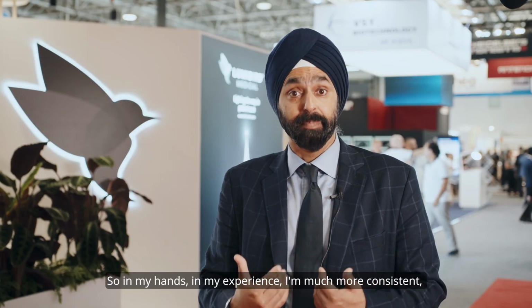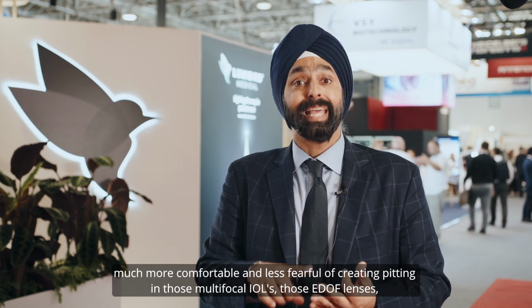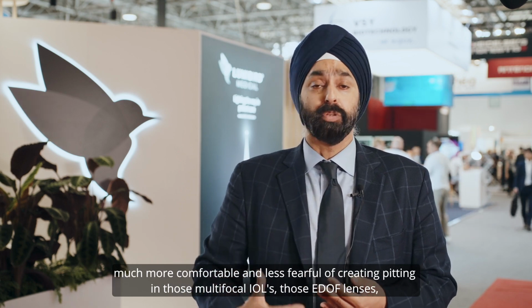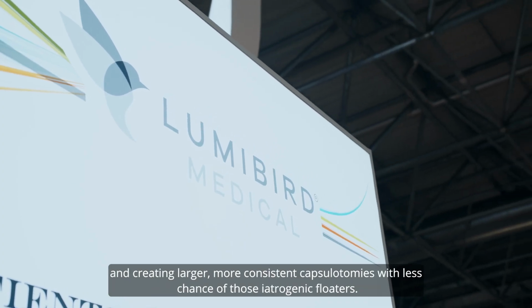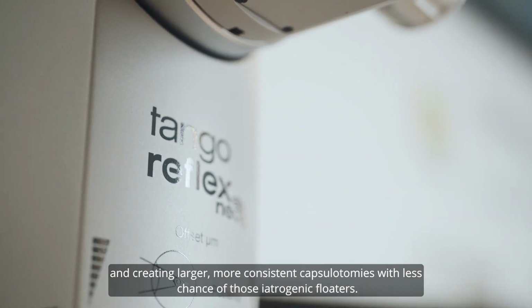So in my hands, in my experience, I'm much more consistent, much more comfortable, and less fearful of creating pitting in those multifocal IOLs, those EDOF lenses, and creating larger, more consistent capsulotomies with less chance of those iatrogenic floaters.